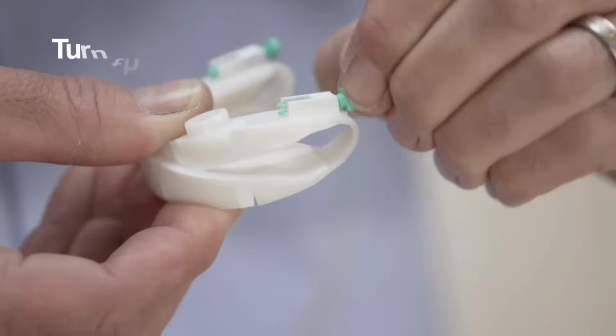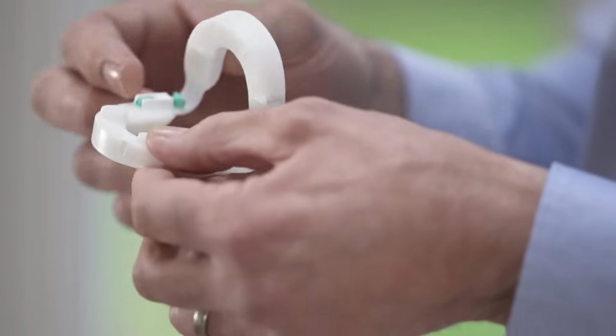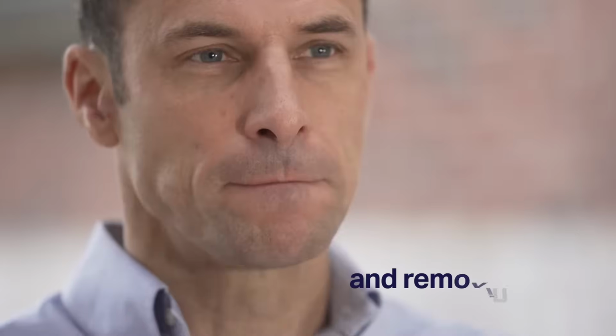Turn the screws on either side of the device clockwise until they're fully screwed in. Fold the oral device so that the screws are on the inside. Practice putting it in your mouth and removing it.